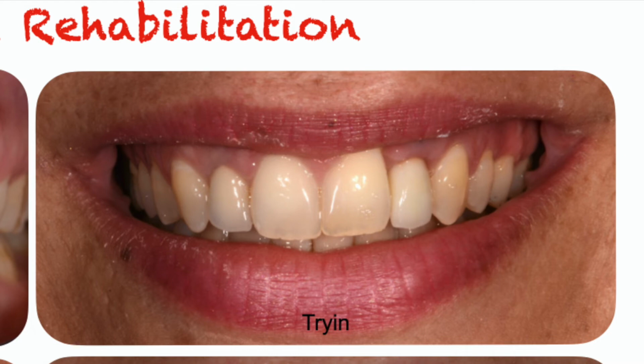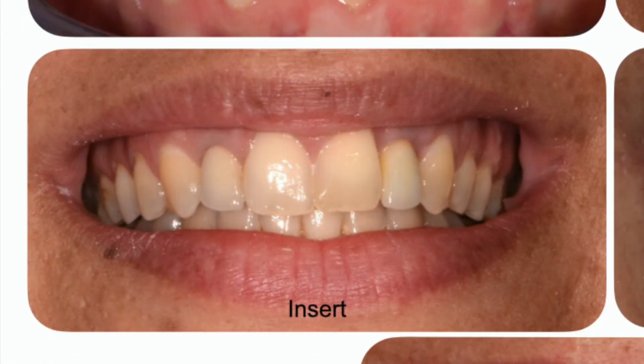And I told the lab that facially, I want a more triangular tooth form. Right there. That line angle needed to be defined. But interproximal, right there. Interproximal, I want some color. And I want some warmth and vitality. Can you see that, surgeon? And so I sent it back, and that's what they gave me. On insert, I had a more triangular tooth form, but still kept a nice, broad, long contact area. And again, interproximally, I have more color.